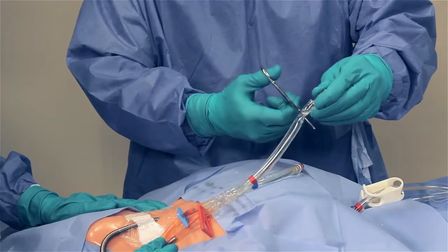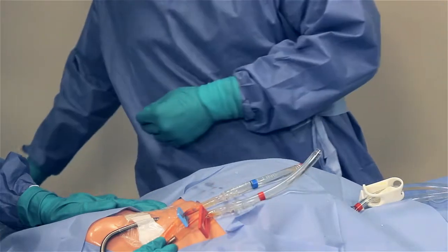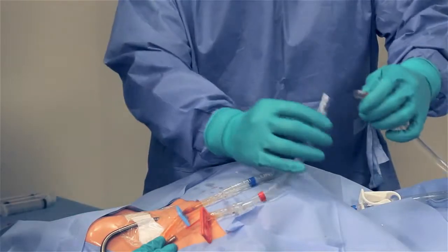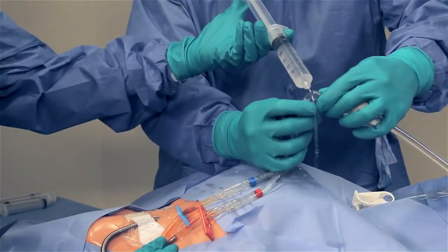When ready to connect the new blood tubing to the catheter, cut away the luer adapters from the red and blue tubing. Insert a barb-to-barb connector into the tubing that remains on the catheter. Using a wet-to-wet technique, connect the blue and red tubing from the new cartridge to the catheter.